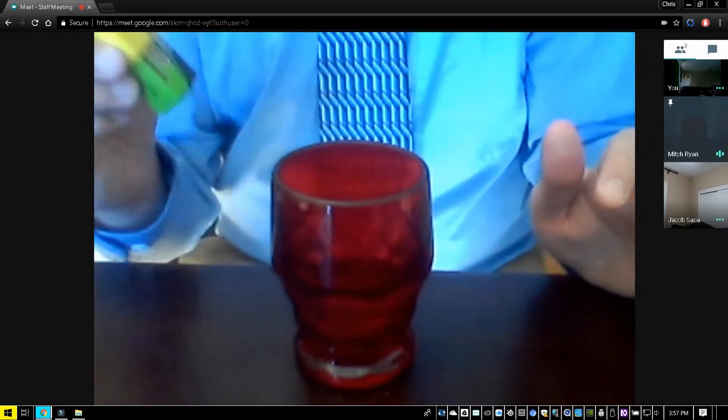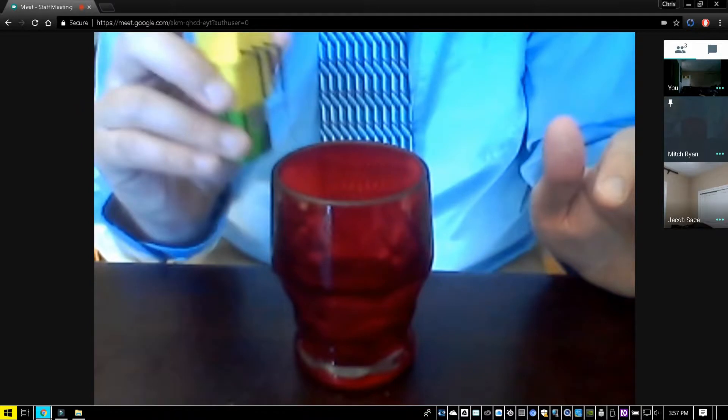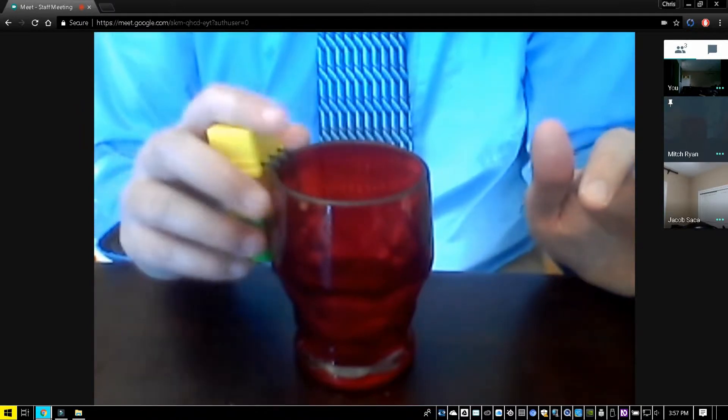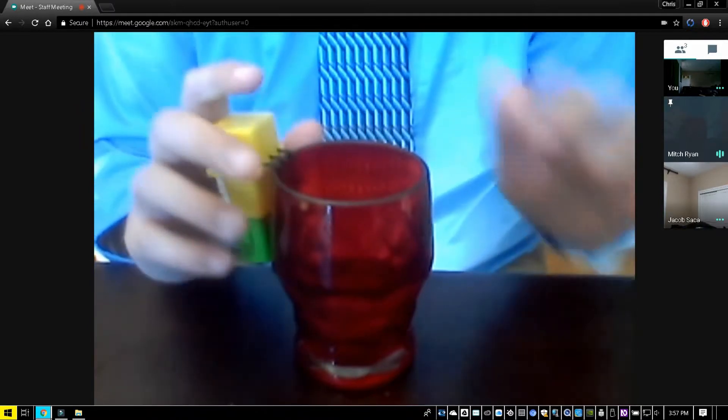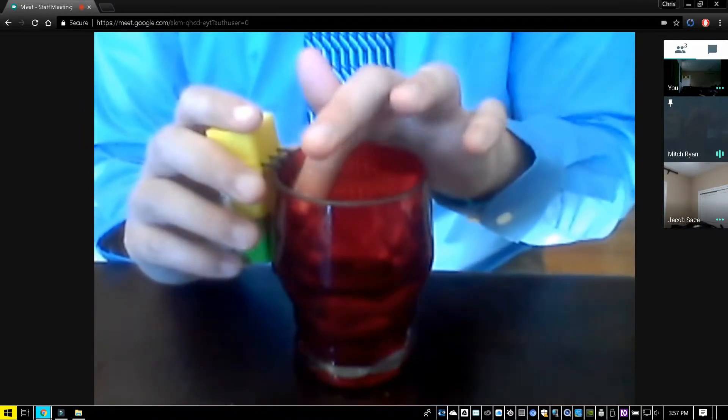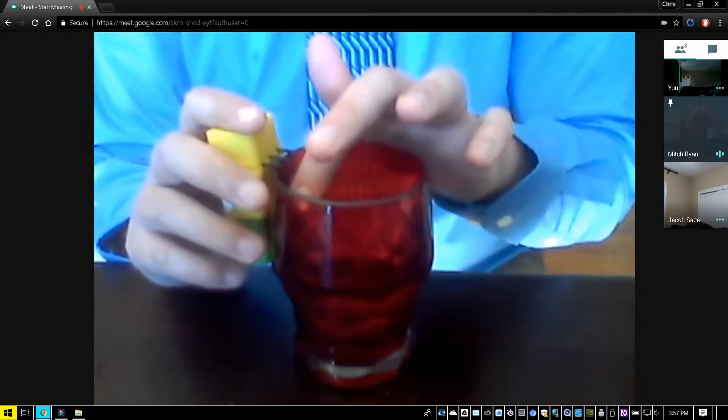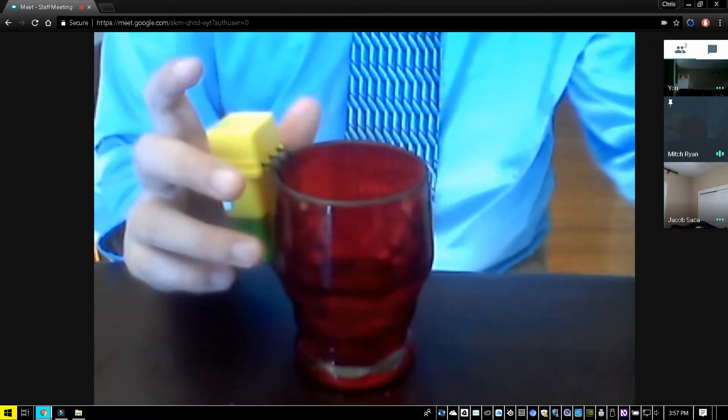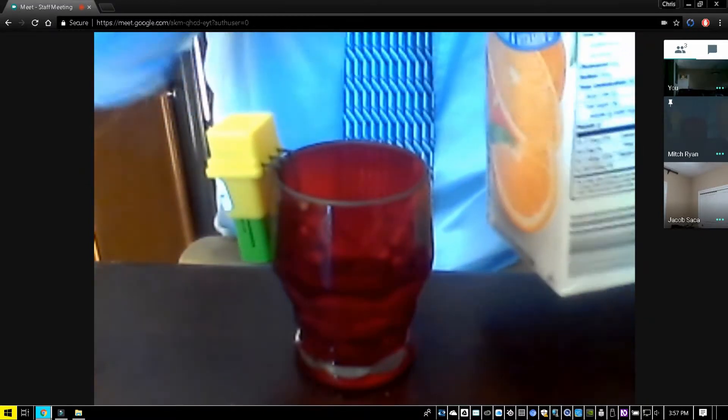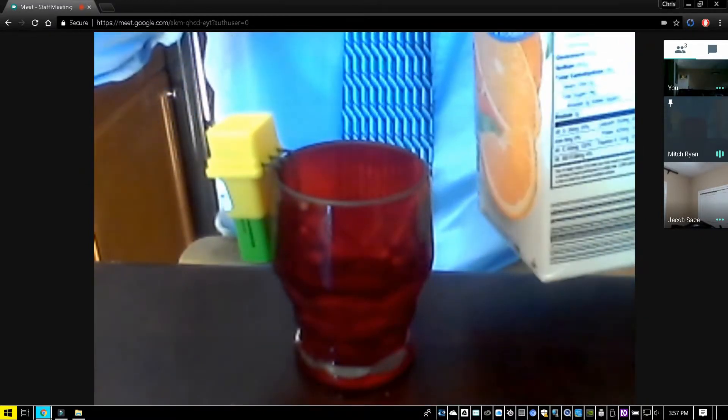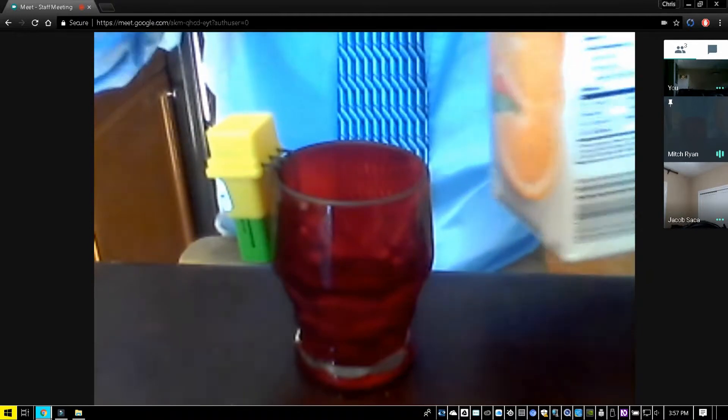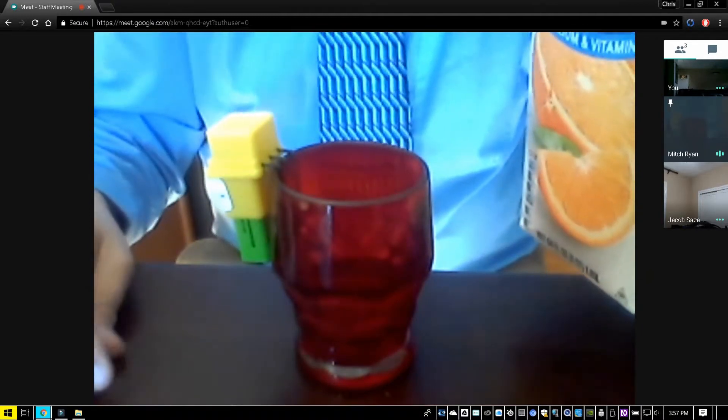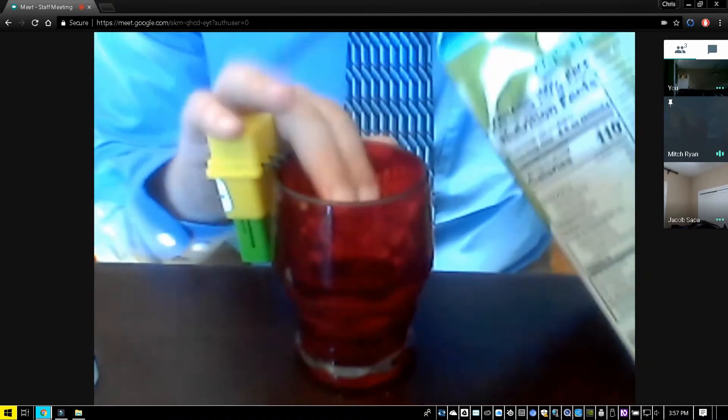I'll just do that now. There we go, the prongs are inside the cup. I have a gallon of orange juice here that I will pour into the cup, and the liquid level indicator will tell me when to stop.